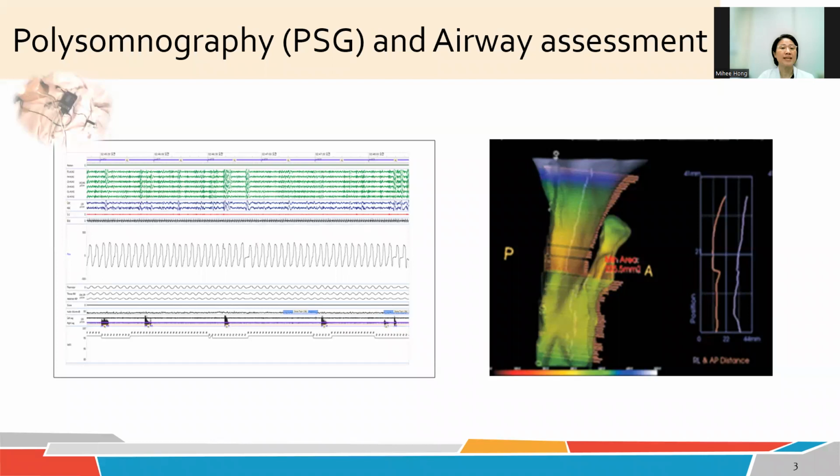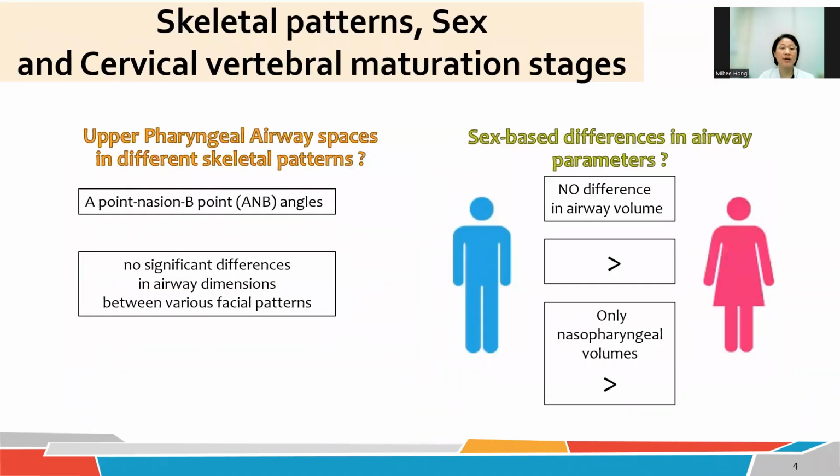Sleep disordered breathing is diagnosed based on polysomnography test results. However, orthodontic offices can serve as convenient points of access for patients who might benefit from further PSG evaluation. Airway volume in growing patients can be changed by natural growth and orthodontic treatment, as well as mandibular advancement devices for helping sleep disordered breathing in orthodontic practices.